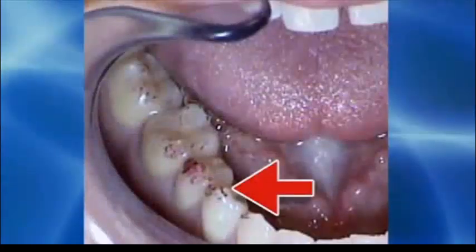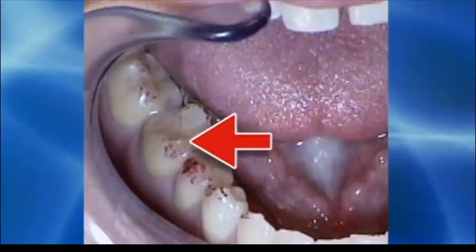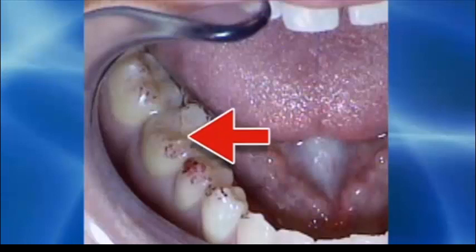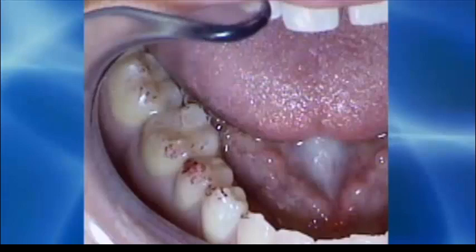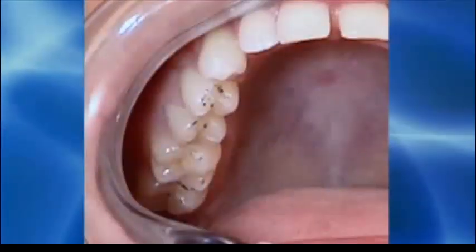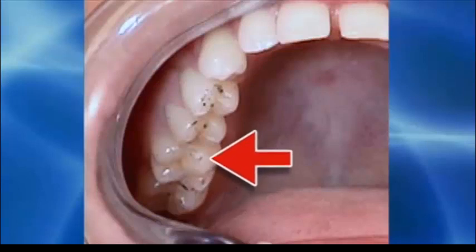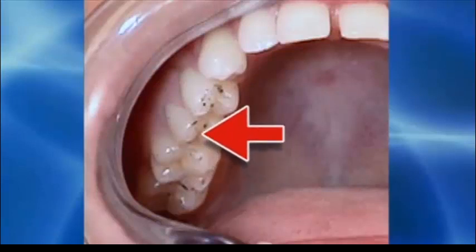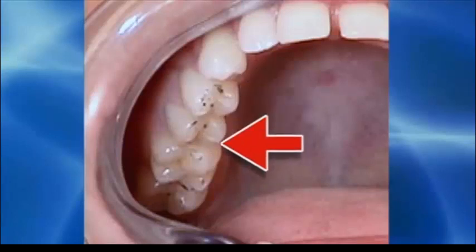She has group function going to the right on this bicuspid, and on this bicuspid, and on this molar. And so these are the contacts that are on the lower teeth that are making up the long disclusion. The most critical one is this one here. It's on the distal buccal incline of the occlusal surface of the second molar. On the opposing teeth, you can see the balancing inclines present on the second molar and on the first molar, both on the mesial and the distal. There's group function contacts coming towards the buccal on both premolars and on the lingual of the second premolar.